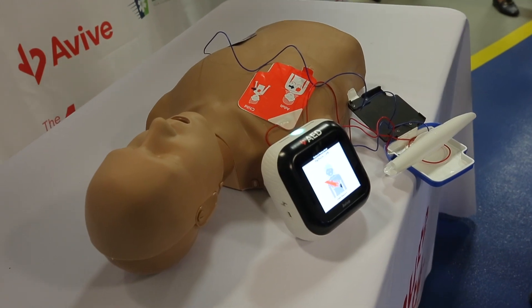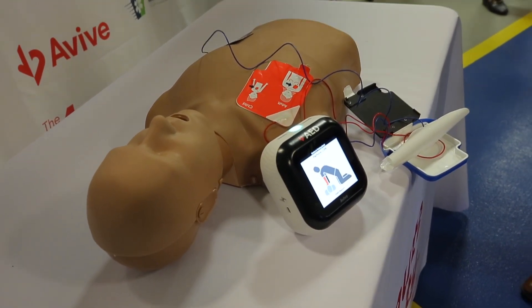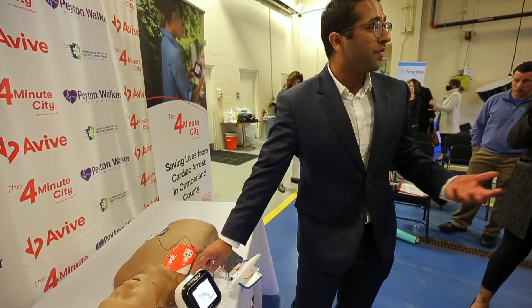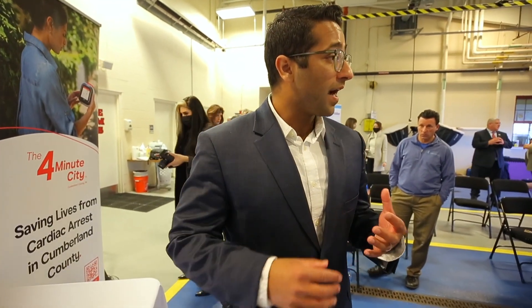It is now safe to touch the patient. Let's begin CPR. Stack both of your hands on the center of the patient's chest. You would follow these instructions until EMS arrives on scene, at which point they'd assume care and start using their own equipment. But this device will keep telling you how to perform CPR.